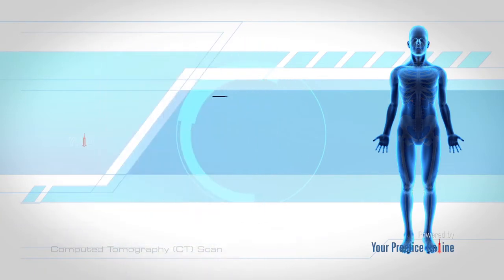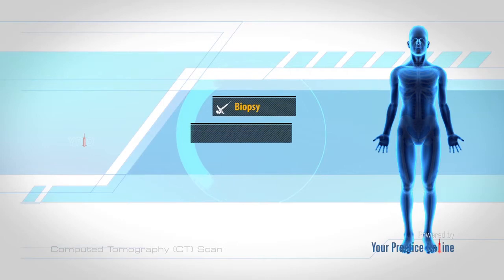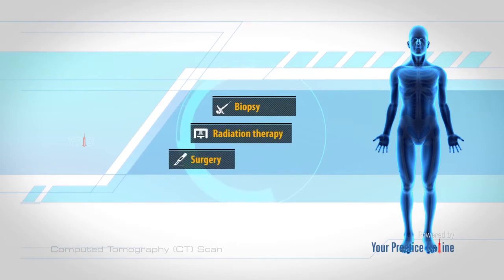CT scan is also used to guide procedures such as biopsy, radiation therapy, and surgery.